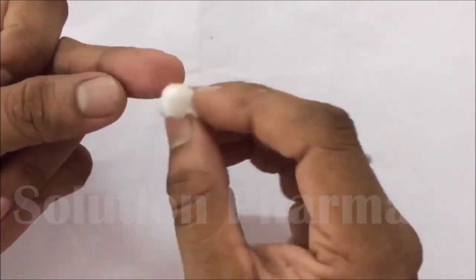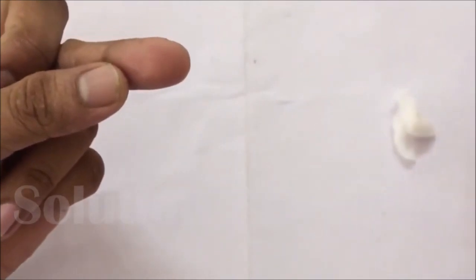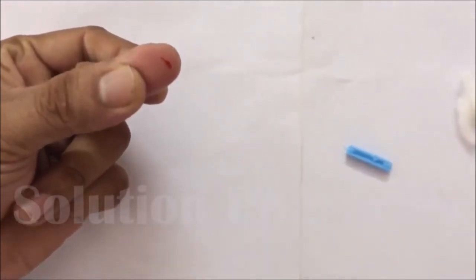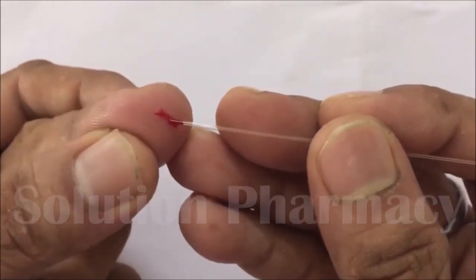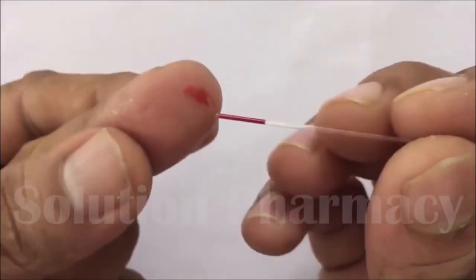For this, first of all, sterilize your fingertip with 70% ethanol or any other suitable antiseptic. After sterilizing the fingertip, prick it using a sterile needle or lancet to obtain free flowing blood. Then immediately start the stopwatch and note the time, and then fill the blood in the capillary tube.